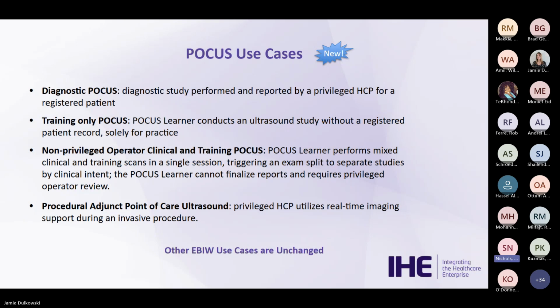And then, as I mentioned, the procedural study, when it comes to using ultrasound guidance, the reporting can get a little tricky. So we wanted to make sure that we had a use case to reflect that and standardize that as well. Next slide.